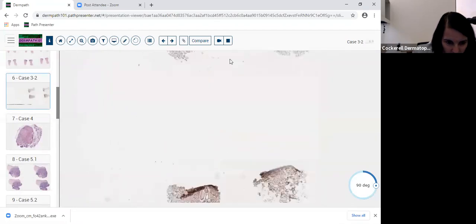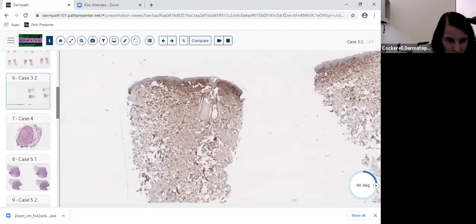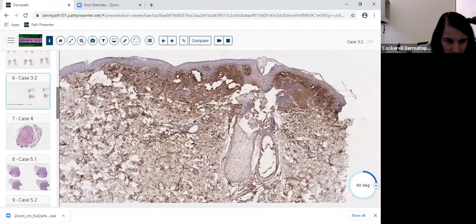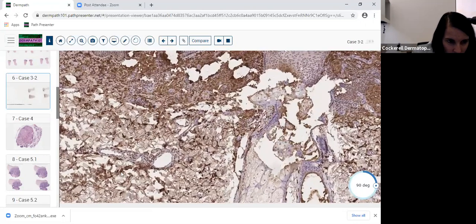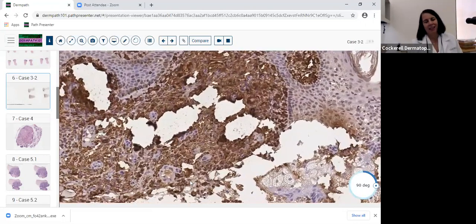Let me get it where it isn't cracked. Let's see, I think this is the best one. So these cells definitely are staining. The vast majority of them are staining with tryptase. So tryptase is in the secretory granules of the mast cells. And when you have systemic mastocytosis, you'll see an increase in the serum tryptase. And you can see these are activated mast cells because they have the tryptase in them.